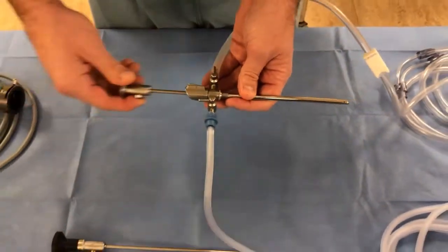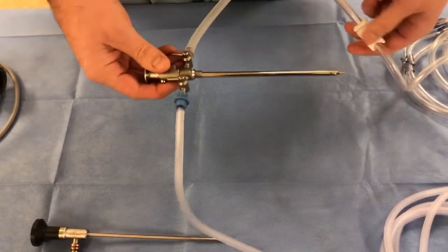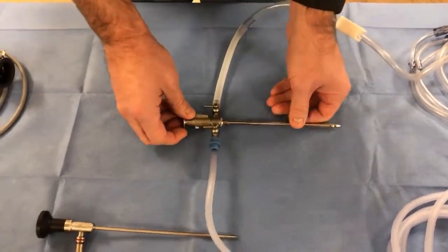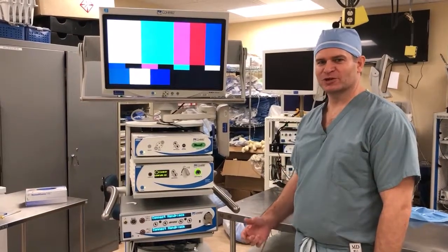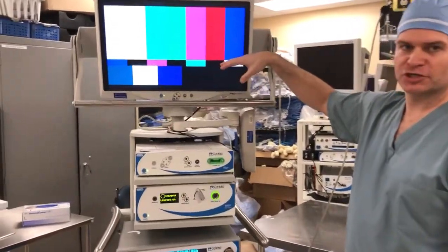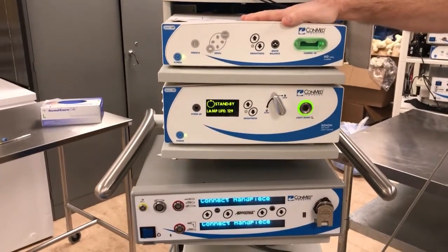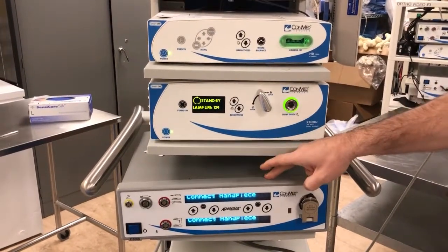The trocar is inserted first — the initial step is to insert the scope sheath into the joint with the trocar. Usually everything will be handed to you with the clamp on and the stopcock turned to off. The tower is basically a station that has a television or video system on top with spaces for everything else that works the arthroscopic equipment — in our case, the computer system, camera system, lamp and light cord system, and power system.